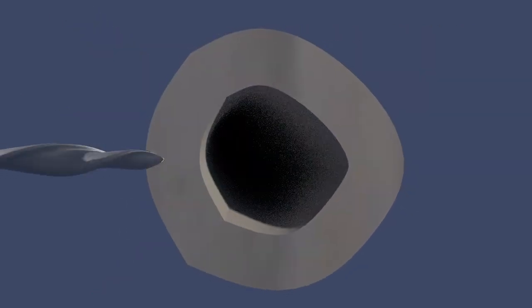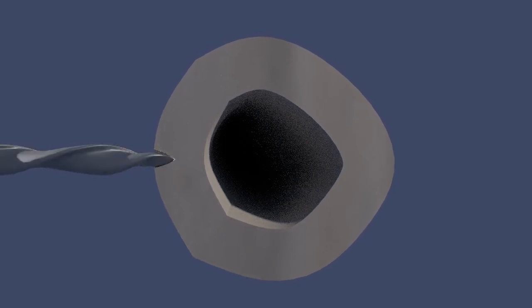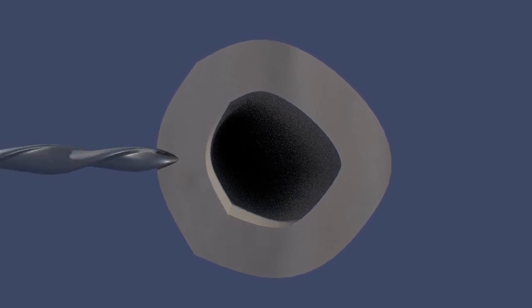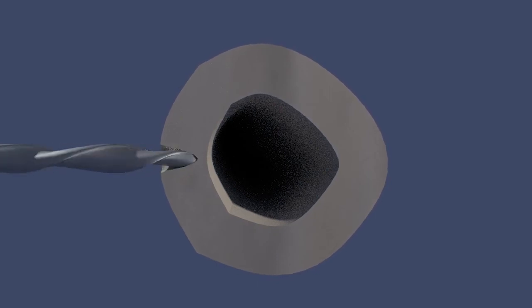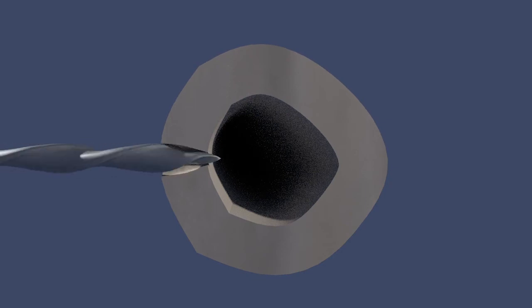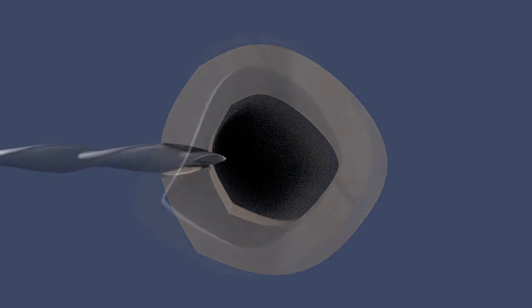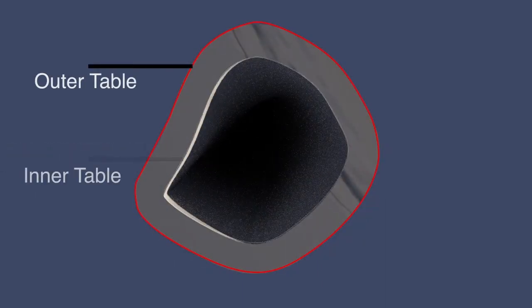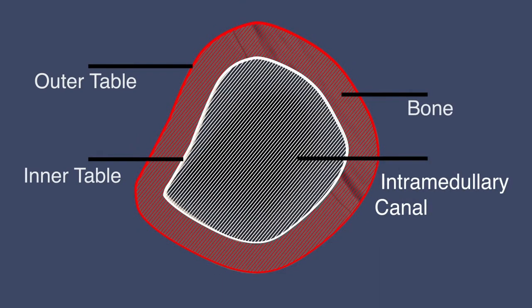Tactile feedback is a critical aspect of bone drilling, as the drill has to feel like an extension of your arms. There are different feelings that you get when you start drilling through the thick cortical bone and when you are about to exit the bone. As you drill through the near cortex, your drill will reach a point where the tip is about to emerge into the hollow section of the bone. We refer to this hollow section as the intramedullary canal.